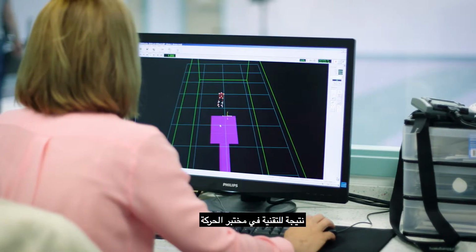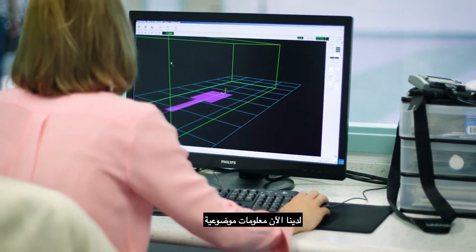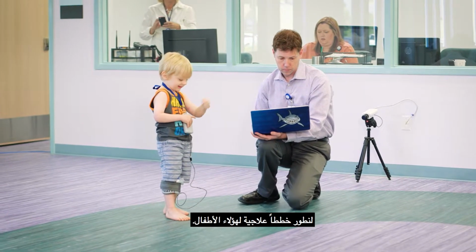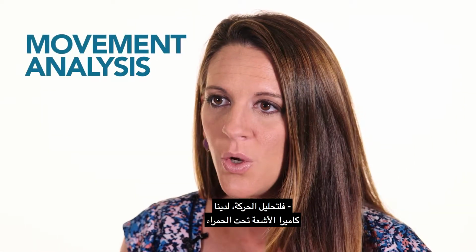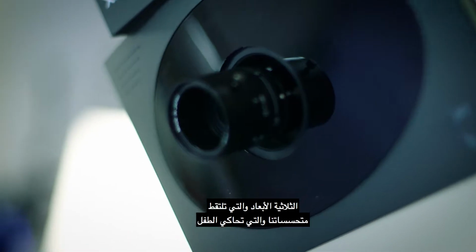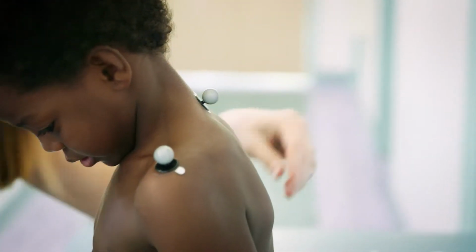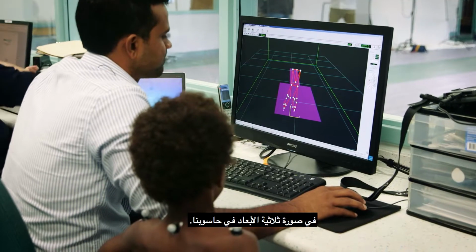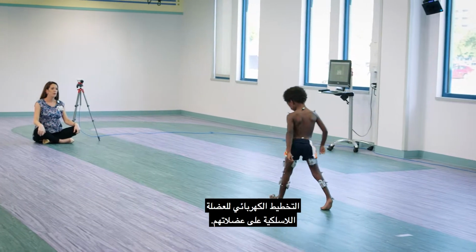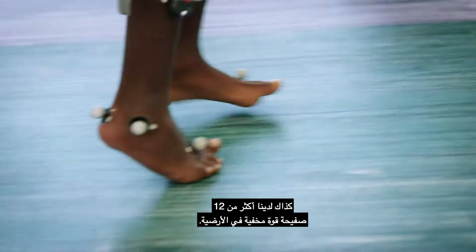Because of the technology in the motion lab that's been provided for us by our donors, we now have objective information to develop treatment plans for these children. For movement analysis, we have our 3D infrared cameras that pick up our sensors and simulate a child in a 3D image on our computer. In addition to that, we use wireless EMG sensors on their muscles. We also have over 12 force plates hidden in the floor.